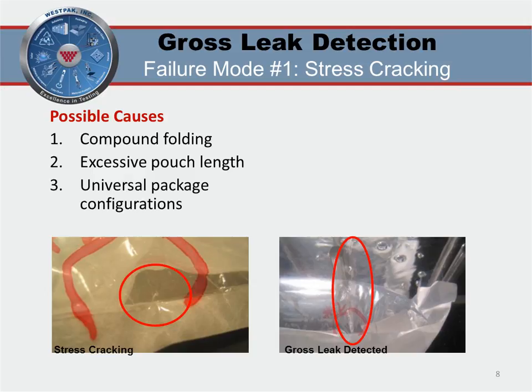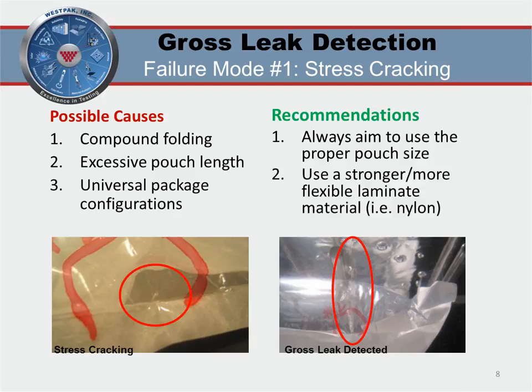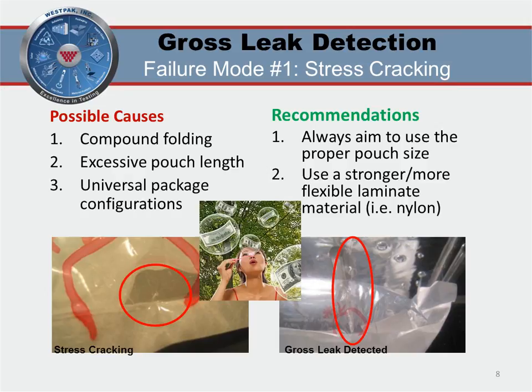It does seem like the easiest thing to do, but this can lead to stress cracking if you're required to fold the pouches. We recommend that you always do your best to use the proper pouch size to either eliminate or at least minimize the amount of folding. Or you can also try using a stronger, more flexible laminate material like a nylon laminate. Using the proper pouch size would definitely help avoid redesigns, and maybe will even help your company save some money if you reduce the amount of pouch material used.